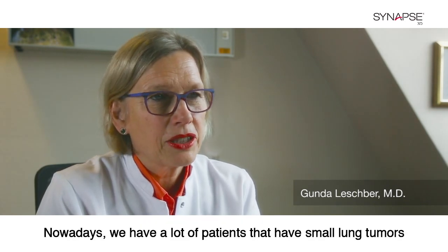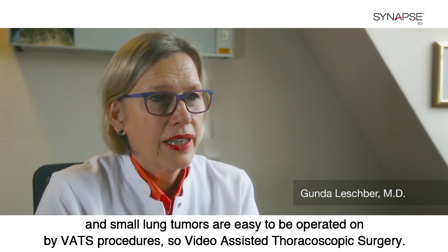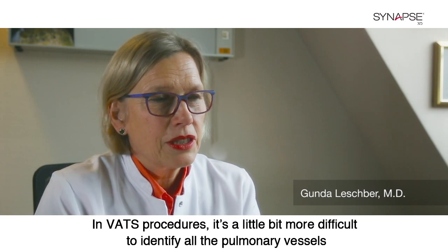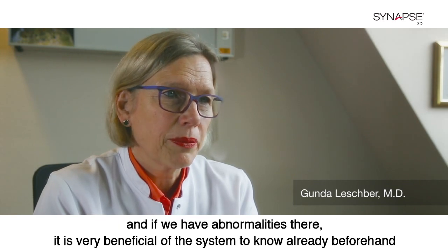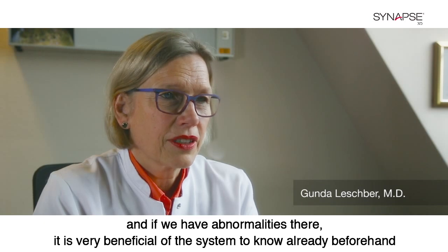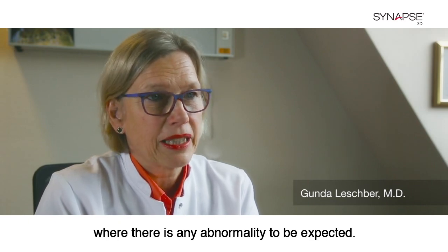Nowadays we have a lot of patients that have small lung tumors, and small lung tumors are easy to be operated on by VATS procedures, so video-assisted thoracic surgery. In VATS procedures, it's a little bit more difficult to identify all the pulmonary vessels, and if we have abnormalities there, it is very beneficial of the system to know already beforehand whether there's any abnormality to be expected.